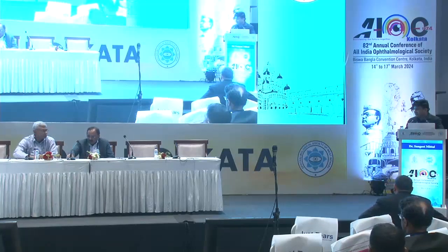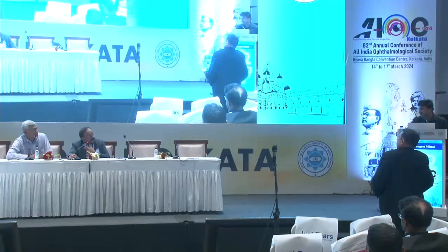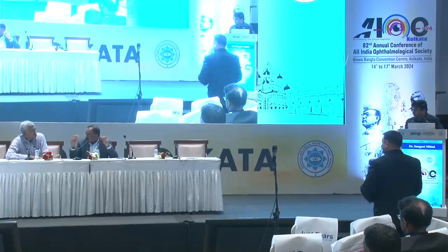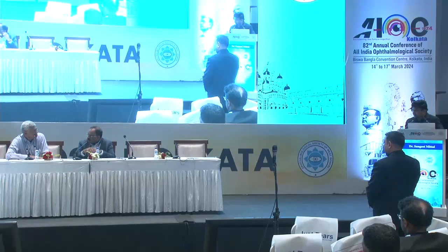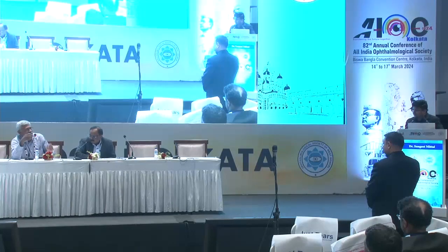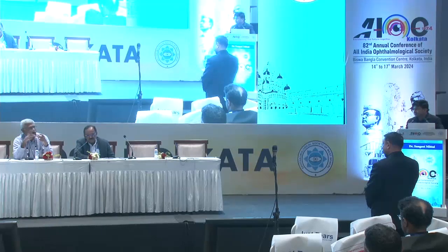Yeah, thank you, sir. But instead of what Mahesh is suggesting, can you not put a cylinder on the tube where the cylinder collects? Instead of the cylinder, I'm saying the bottle. Yeah, but actually, what I do in these cases is I connect a small bit of tubing. That tubing you disconnected, from the cutter to the connector. Reverse it, and the other side is connected to a 10cc syringe, and the whole thing is aspirated by the assistant. So it directly goes into the syringe.